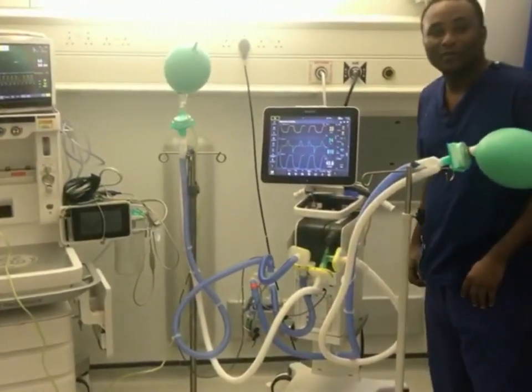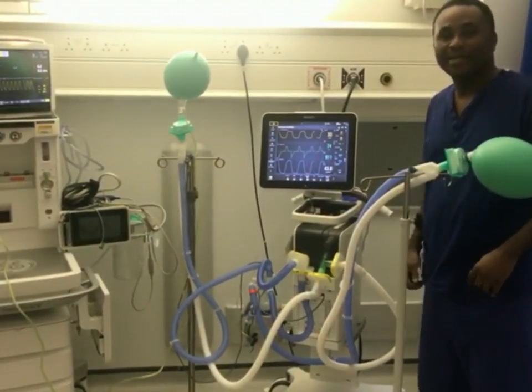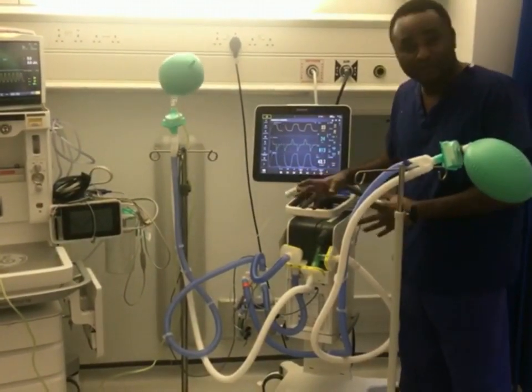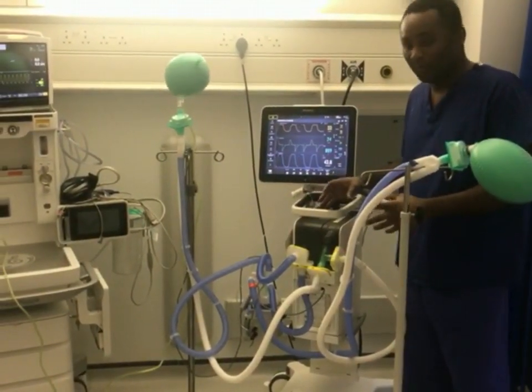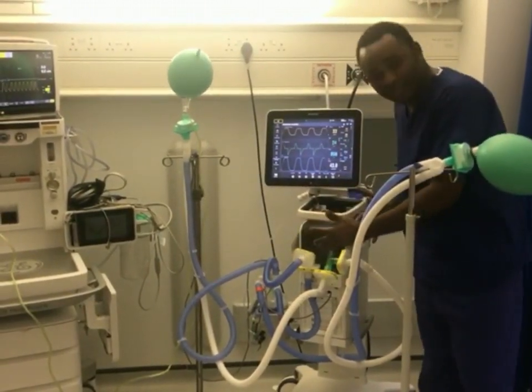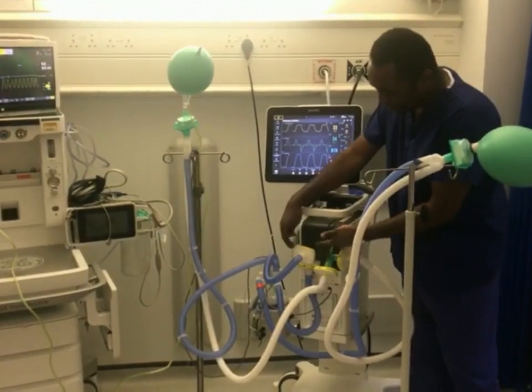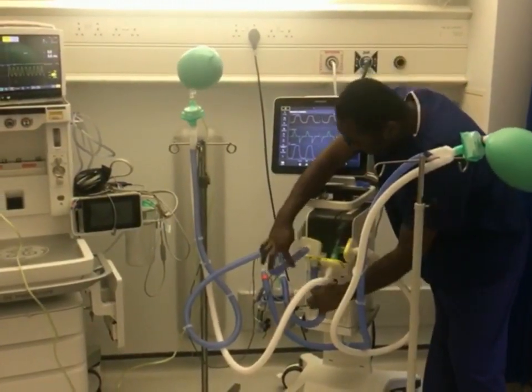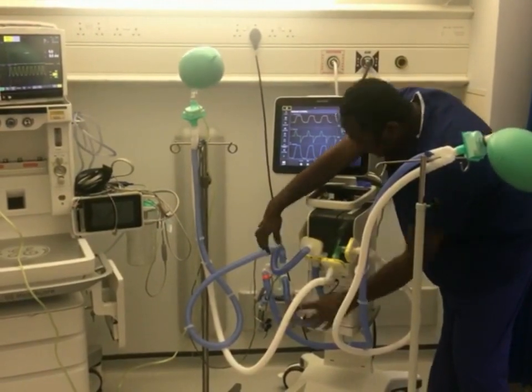Hi, I'm Jonathan, one of the lead technologists in ICU at King's College. As you can see, we're trying to see if we can ventilate 2 patients using one ventilator. When we look at our fresh gas tubing, you can see we have 2 bacterial filters connected to our inspiratory lanes.